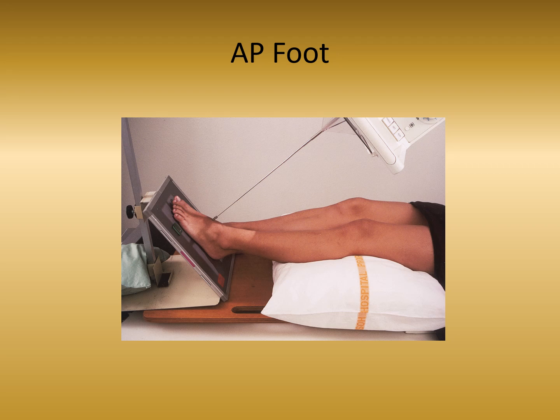So this is another example of where we're bringing the equipment to the body part to try to make the recipe happen, right? Our central ray recipe and our plantar surface of the foot placed on the IR. That's part of our recipe of positioning an AP foot. Central ray is going to be perpendicular to the IR for the trauma positioning of the foot.